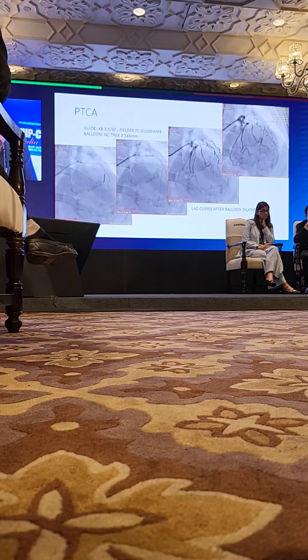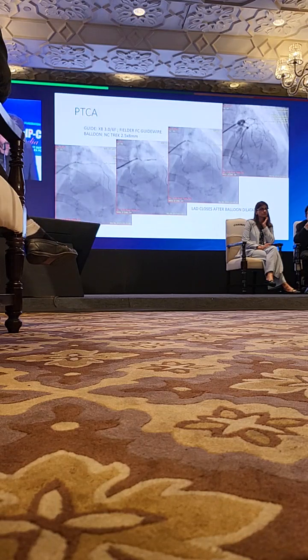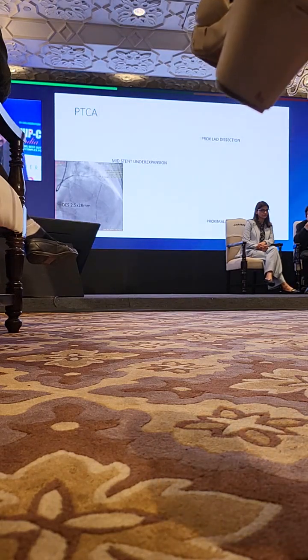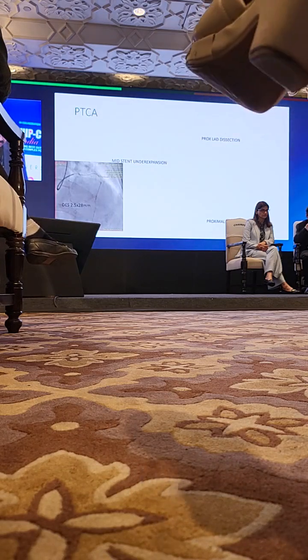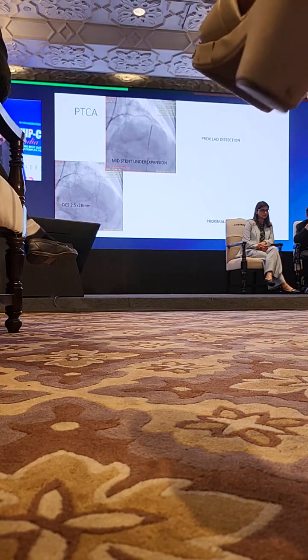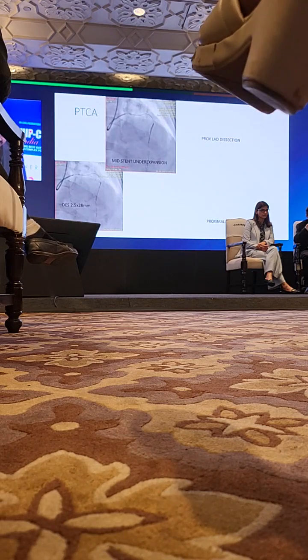So I did another dilatation beyond the no flow part, and then straight away took the patient for stenting. So took a longer stent from the diagonal, beyond the diagonal to the lower part, and then after the stenting, I could see that a mid portion of the stent had remained unexpanded.